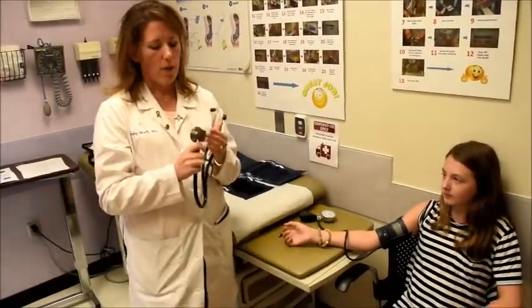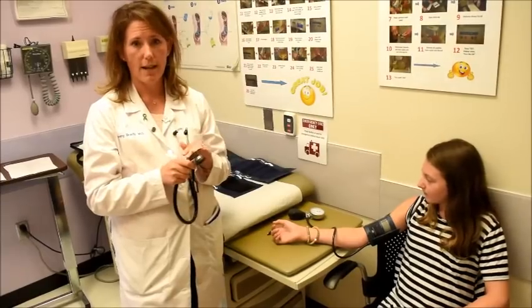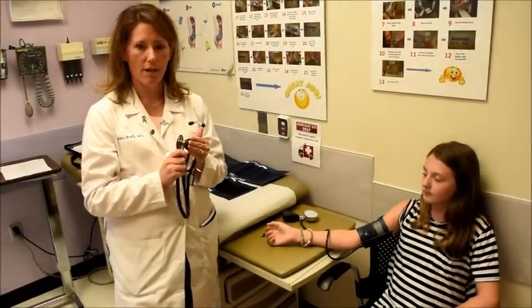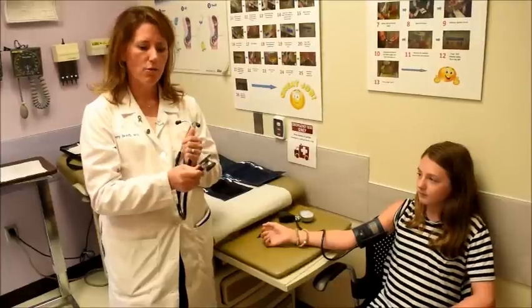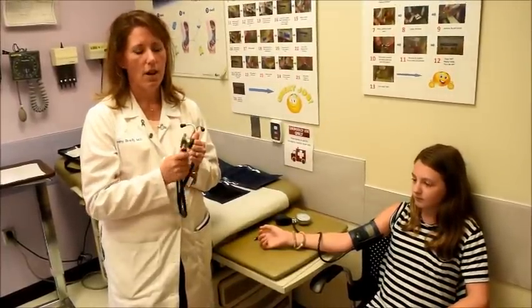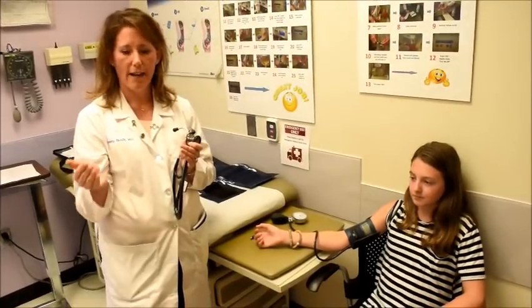Okay, so with blood pressure measurement, you really want to focus on using the bell of the stethoscope, not the diaphragm, because at this point, the bell allows you to best hear the Korotkoff sounds. And you really want to make sure that you apply very light pressure, because that allows you to best hear, again, the Korotkoff sounds. We're going to be measuring K1, K4, and K5.